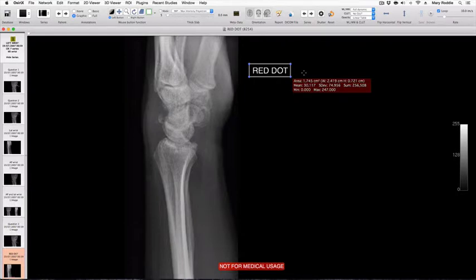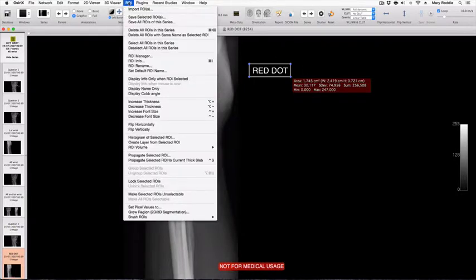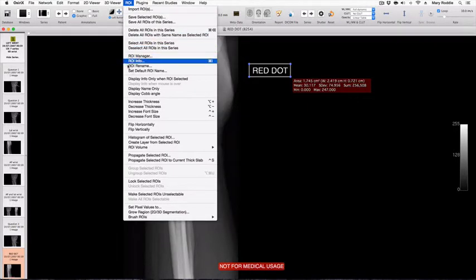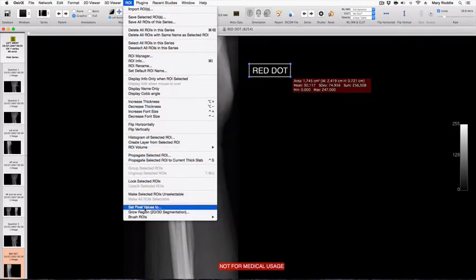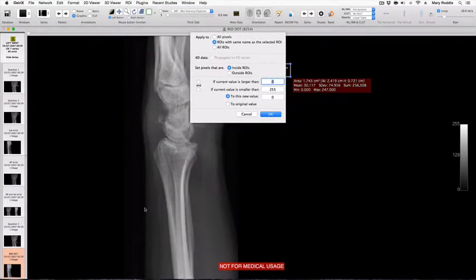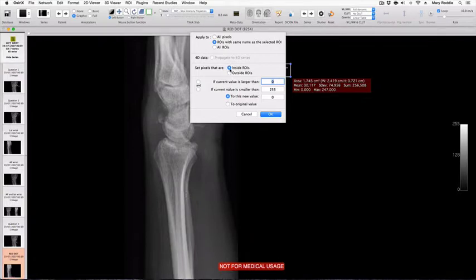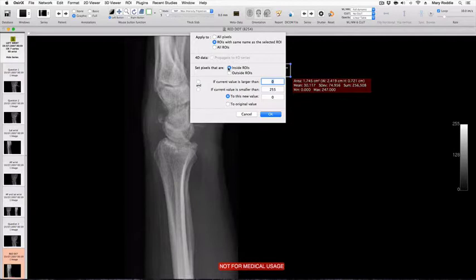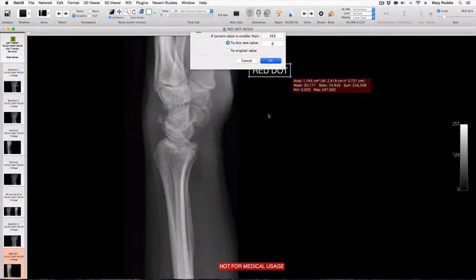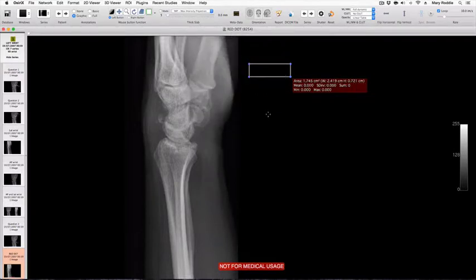Now this time we need to go to the menu bar labelled ROI and go down to the text that says set pixel values to. When you get that, the box will ask you whether you want to get rid of the pixels inside or outside the ROI. In this case we want to lose the pixels inside the ROI, so we make sure that that's clicked and then press OK and the text has disappeared.